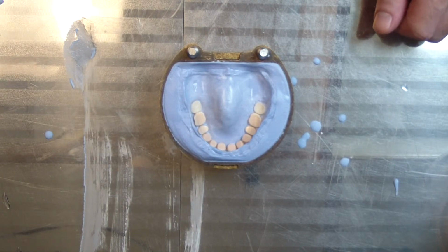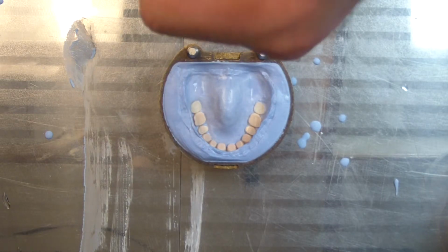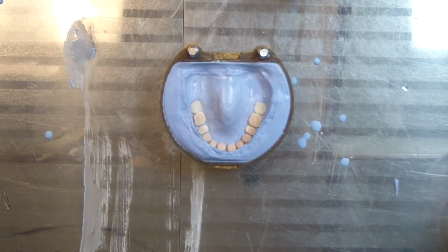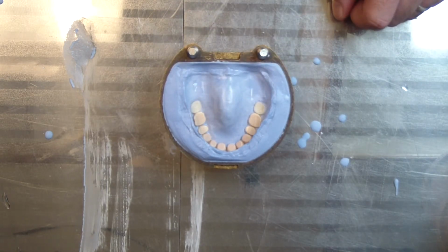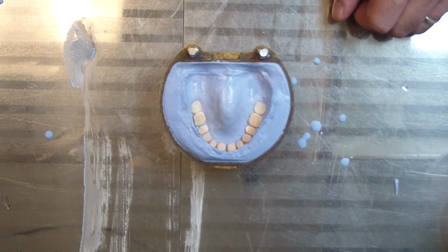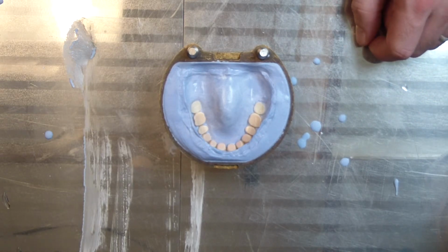So what I did here is when I waxed up the denture, I took my thumb and pressed it in the wax on the palate right here a little bit, just so it gets my fingerprint, and when I poured it up and boiled it out, I checked and there's a nice replica of my fingerprint, which I'm obviously going to polish out when the denture is processed, but until then that's going to stay in pretty well. So that's the flasking process of it.